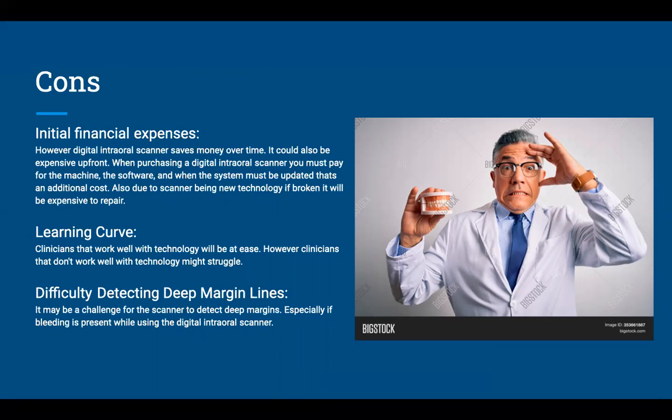And also, there is a learning curve to intraoral scanning. Typically speaking, clinicians that work well with technology, and usually they're younger, it will be easier for them.